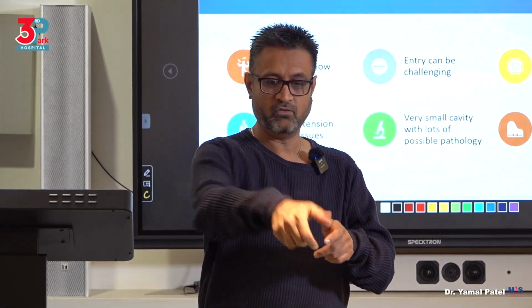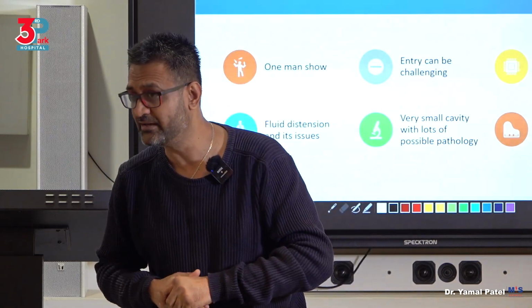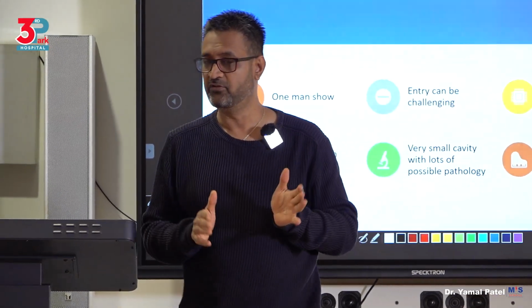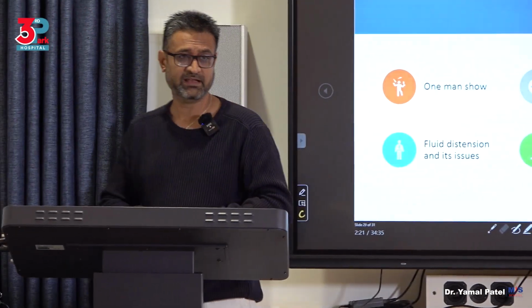You have to be holding, cutting, pulling, cut, hold this way, lift, cut. So you see, you're working with two hands. In laparoscopy, it's two-handed all the time. If you're assisting me with one hand, ask my team what happens. I get upset. You should understand that surgery in laparoscopy is two-handed.